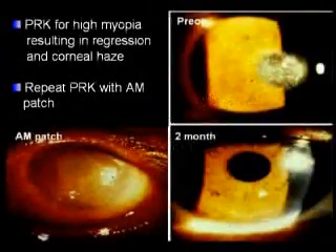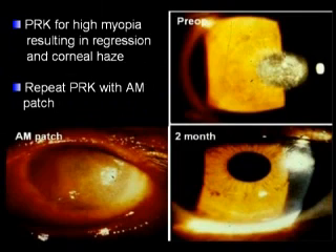This shows how amniotic membrane may be used in patients with excimer laser ablation such as PRK or PTK. Dr. Kim from Korea has used amniotic membrane in this case with cornea haze due to previous PRK for high myopia.